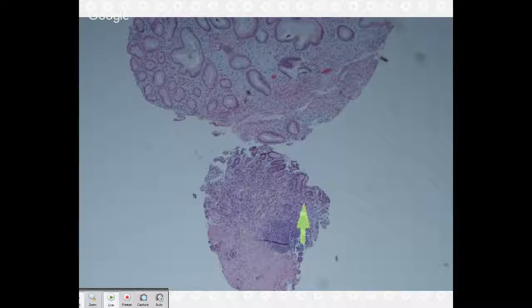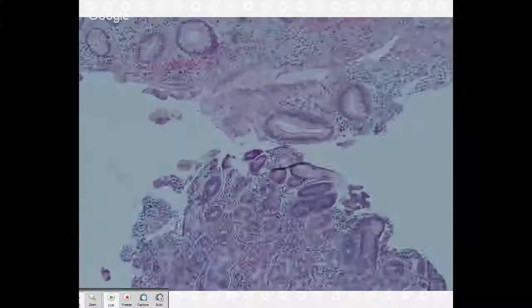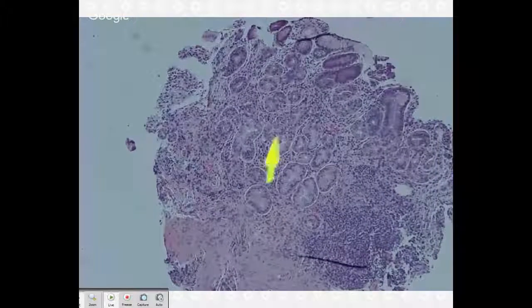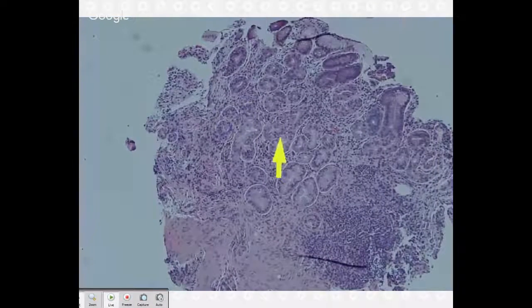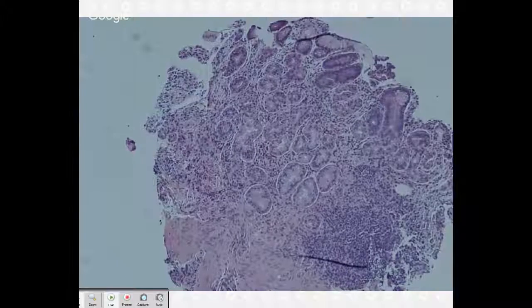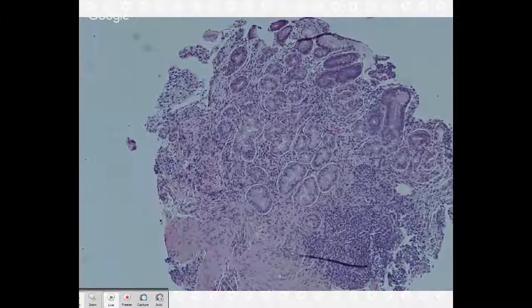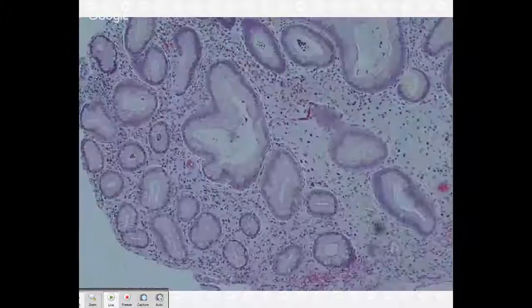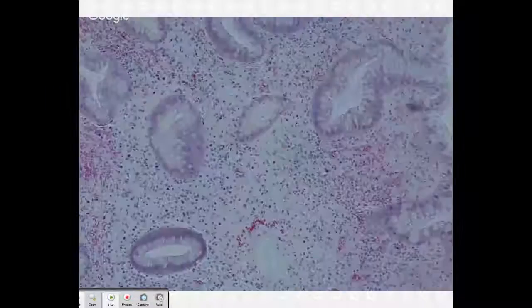And you look at that and you're like, that's not normal mucosa. That's way too inflamed. Where is all my oxyntic mucosa? They tell me I'm in the fundus, and this certainly doesn't look like fundus. Maybe this patient actually has autoimmune gastritis, and I have the hyperplastic polyp because of the damaged mucosa. Perhaps I should raise that possibility to my clinician.